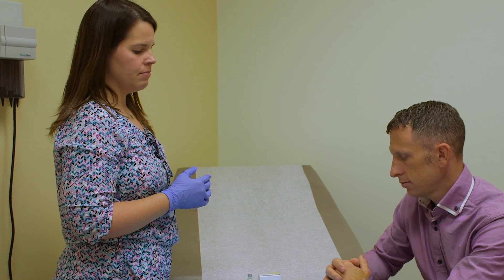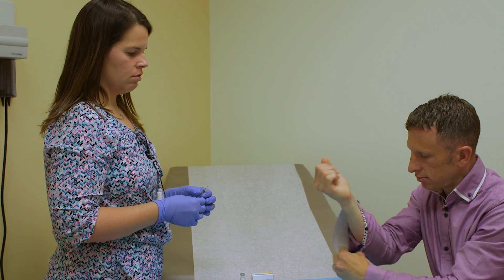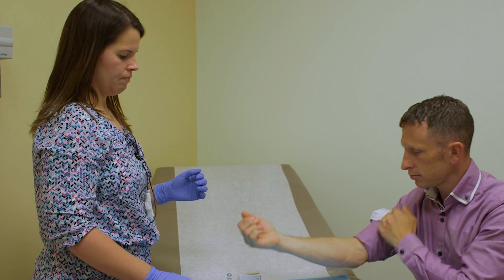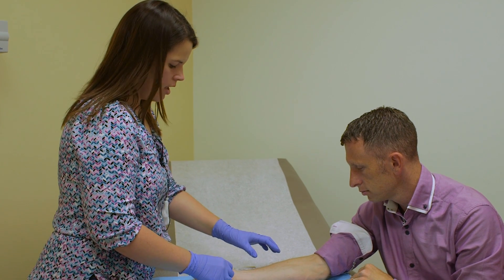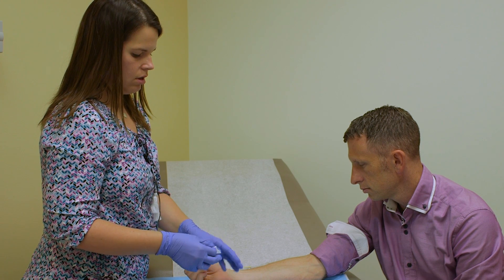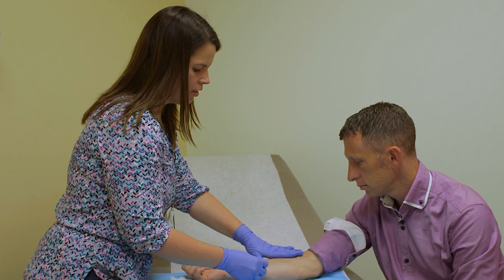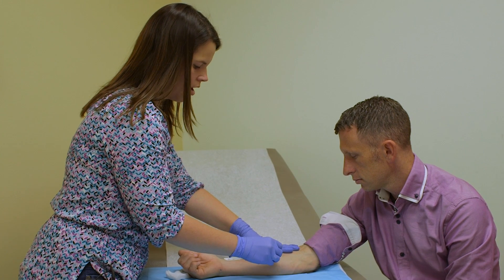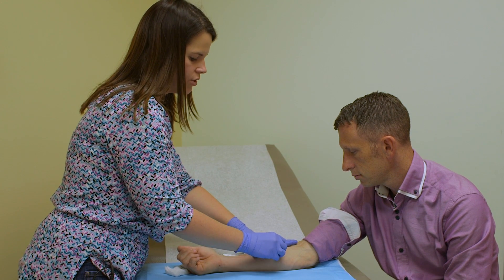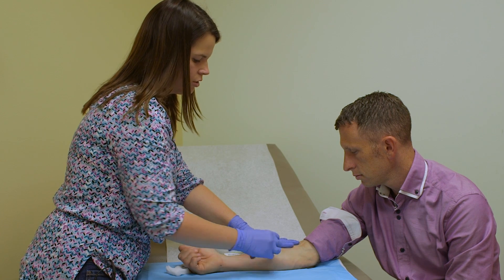The first thing you want to do is ask your patient if they prefer a specific arm. Today we're going to be doing the patient's right arm. Take your alcohol swab and clean in a circular motion. We're going to be placing the test on the flat portion of the forearm. Make sure you avoid any veins or hair.